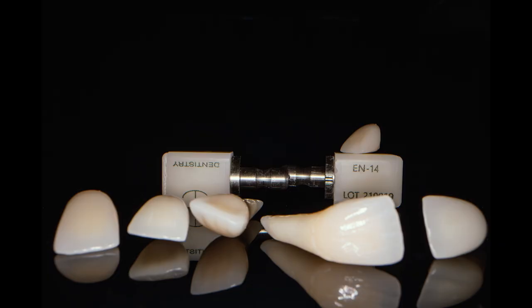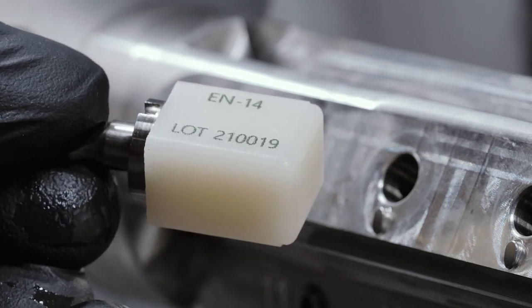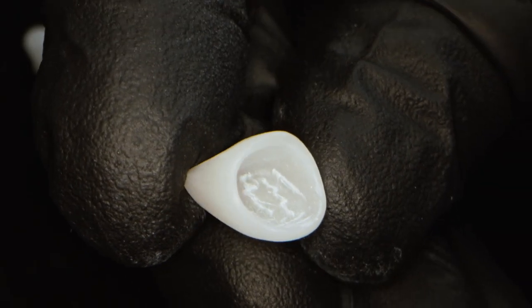Today I want to show you how easy it is to characterize a crown milled out of an Edelweiss CAD-CAN block. I use an Edelweiss T-Block and have the unique advantage of painting it from the inside.